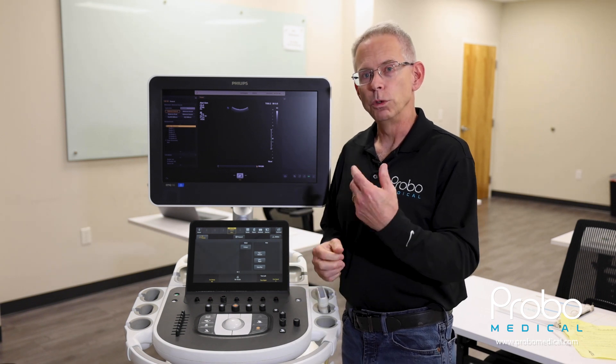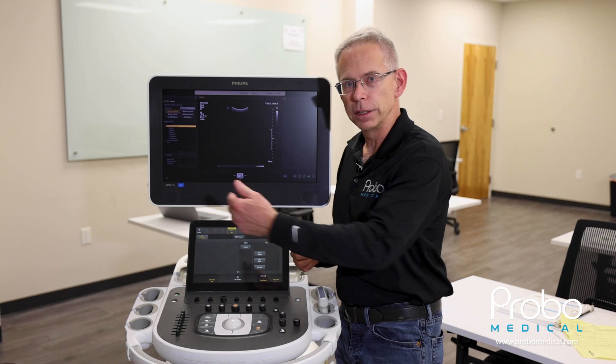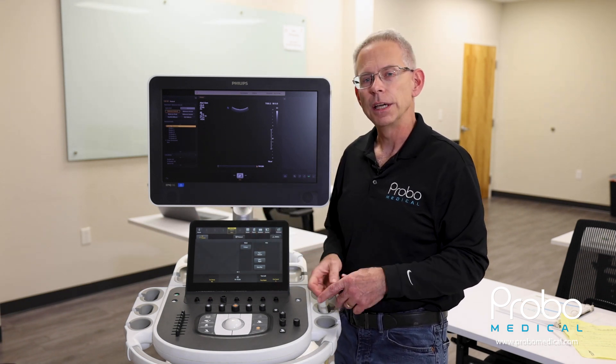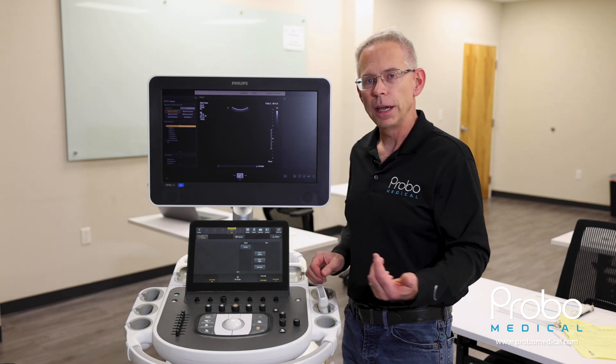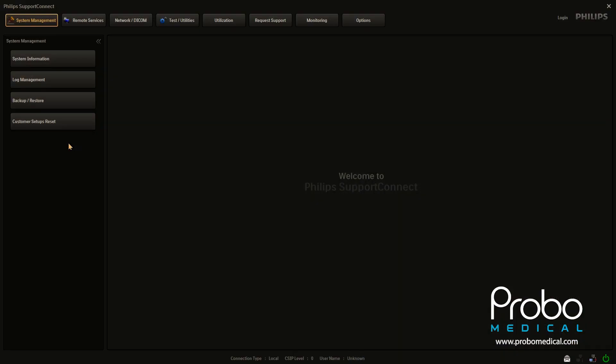So you will need a USB drive, and you want to insert that on the left side of the user interface in the USB slot. Give it a second, and then press the support button, and it will take you into the screen where we'll continue from there. If you have your USB flash drive inserted in the unit prior, go ahead and just off of the system management page, you want to come down to backup, restore.